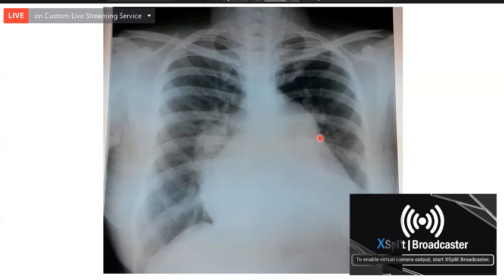RA can also be enlarged. RA enlargement indicates that the patient may be having associated volume overload, and it may be because of tricuspid regurgitation or a large volume of blood coming to the right ventricle and right atrium. In a patient with ASD, blood flows from the left atrium to the right atrium to the right ventricle.